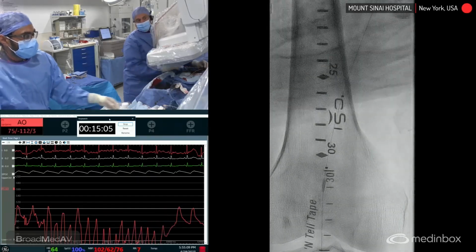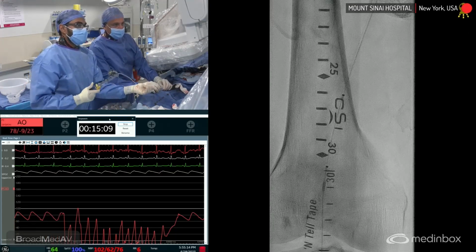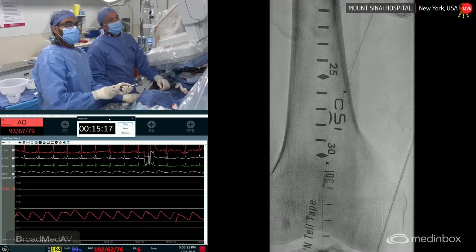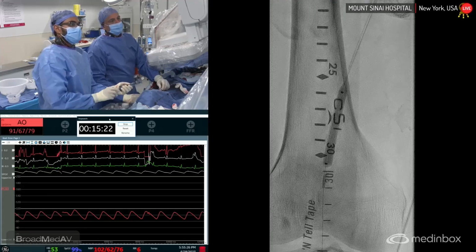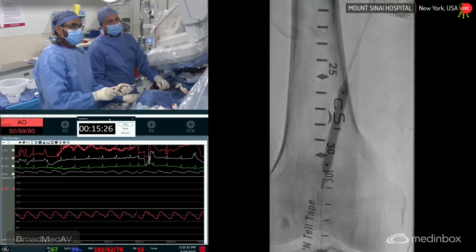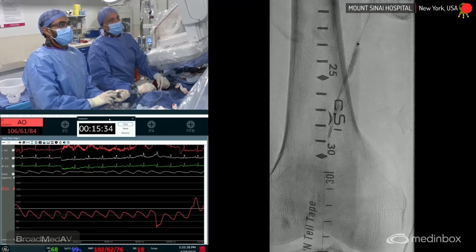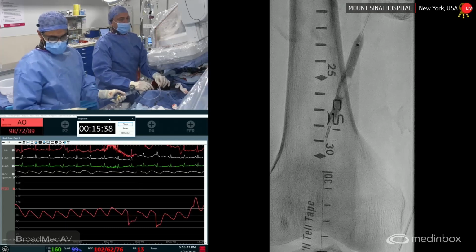So there's a good balloon. It's called a Dorado. Very strong balloon, capable of being inflated to high pressures. Okay. Made of Kevlar, right? It's made of Kevlar, exactly. Go up. 12, 14. So really open it up. We go high pressure, then down. Go up here. 20. Okay, down. Good. Okay, now that it's down, we're just gonna walk it out.